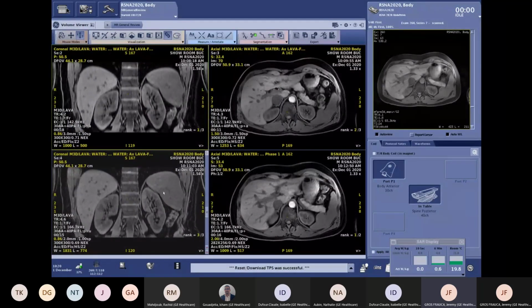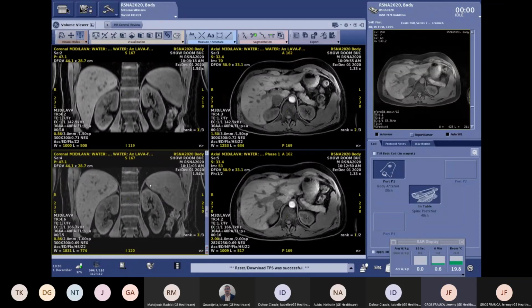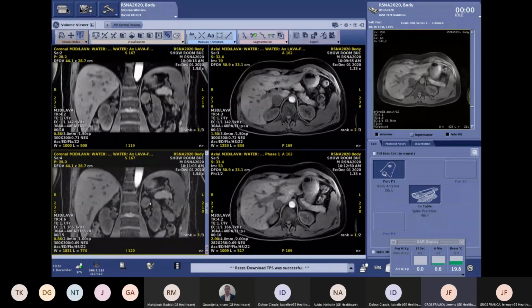And here you can see the 18 seconds breath hold. And here, the 15 seconds result with coronal reformat. So by using 2 mm slicing times, you are really improving your image quality in any plane.